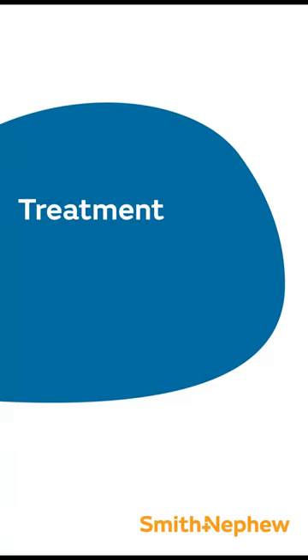Comorbidities in combination with aged skin can place an individual at an increased risk of infection, resulting in complications and a delay in wound healing. Starting the appropriate treatment as soon as possible improves patient outcomes. Therefore, patients and caregivers should be educated to perform first aid when a skin tear occurs, in order to preserve the viability of the skin flap wherever possible.